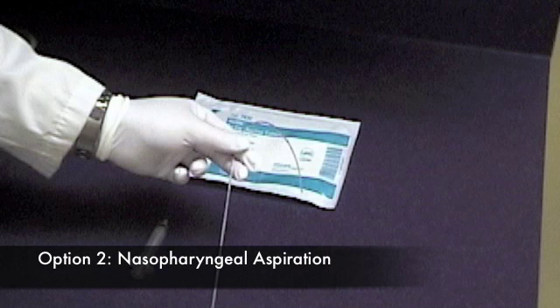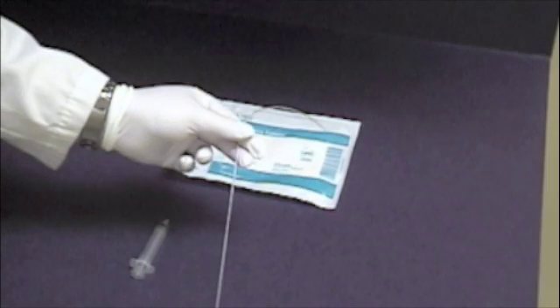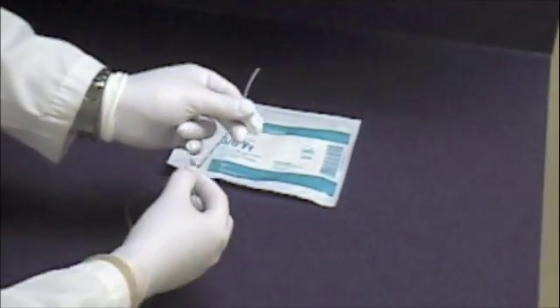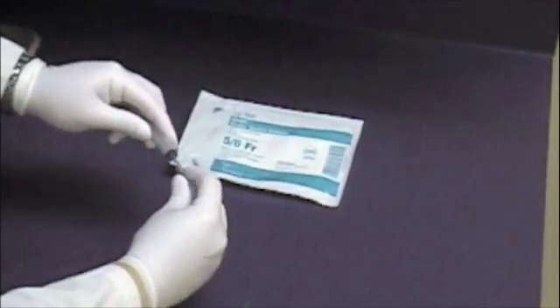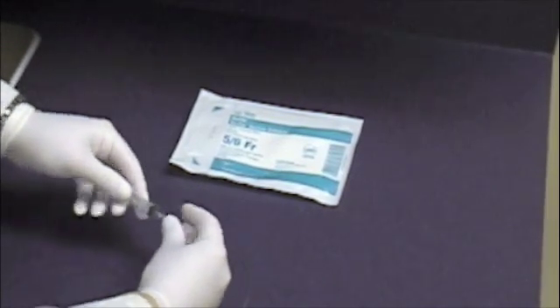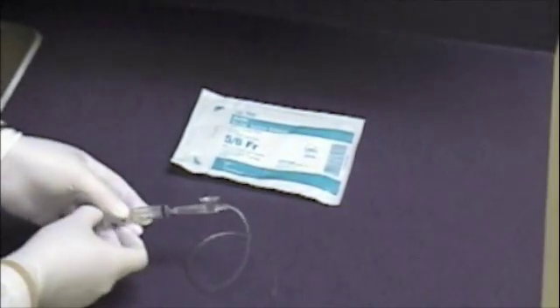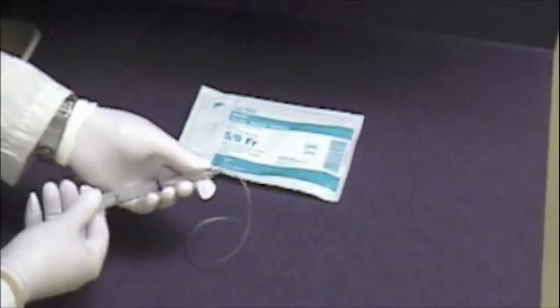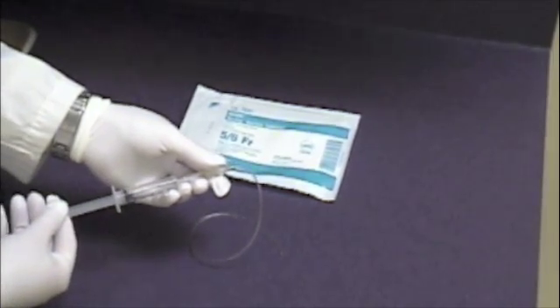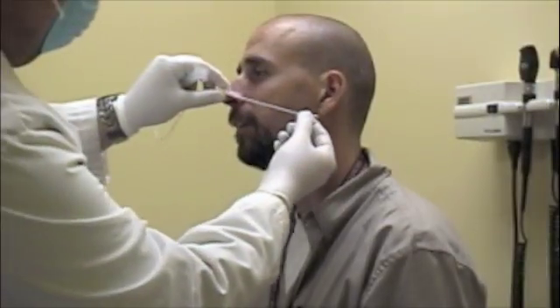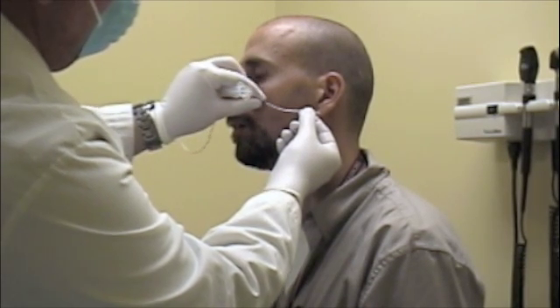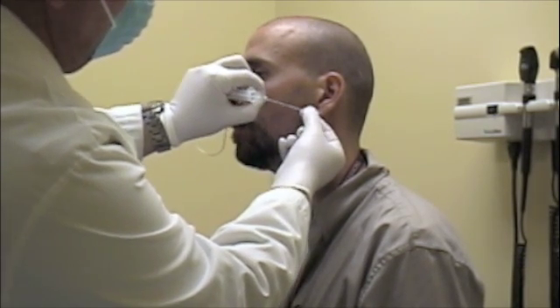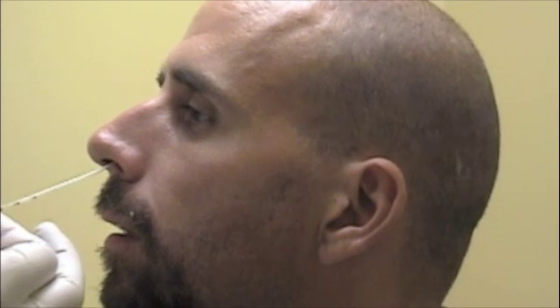The second option is the nasopharyngeal aspirate. The tubing has calibrations to help with measurement. The syringe is attached to the tubing and is manually occluded during aspiration. Measure from the corner of the nose to the front of the ear and insert the tubing one-half to two-thirds this length along the base of the nose.